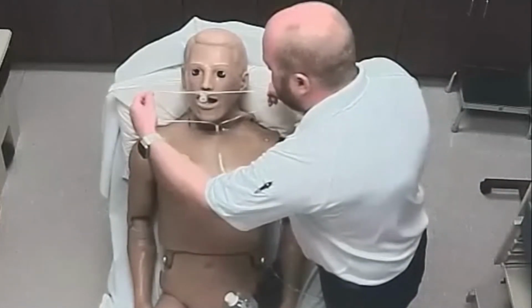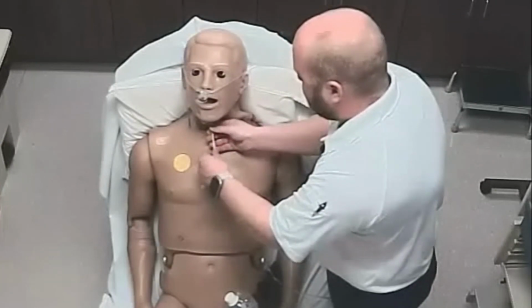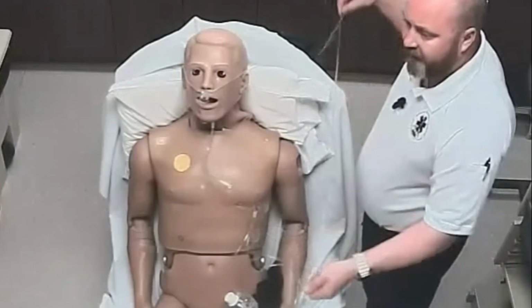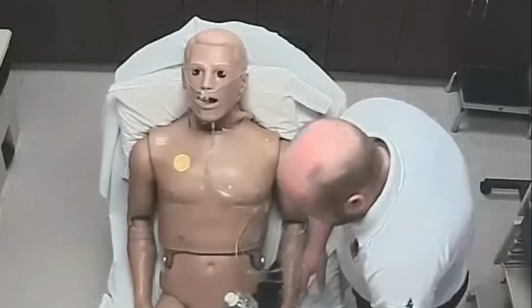So we're going to slide it into the patient's nose. Make sure you're talking to your patient, advising them what you're doing. They might have a little tickle or a weird smell. Go ahead and get your baseline capnography reading. So hook that up to the monitor and get your baseline, let it set.